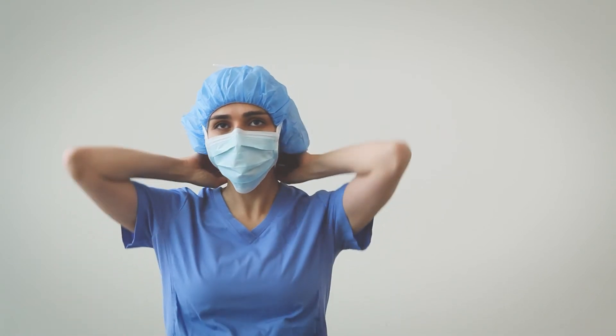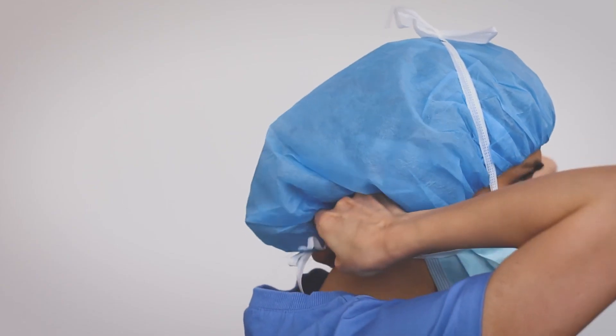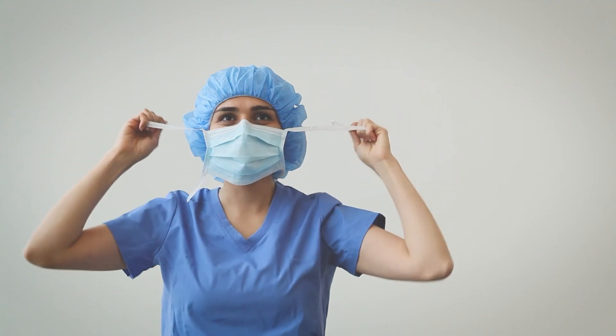When you are ready to remove your mask, make sure your hands are clean and release the mask by breaking or untying the bottom ties followed by the top ties. Avoid touching other parts of the mask to prevent contamination and discard appropriately.